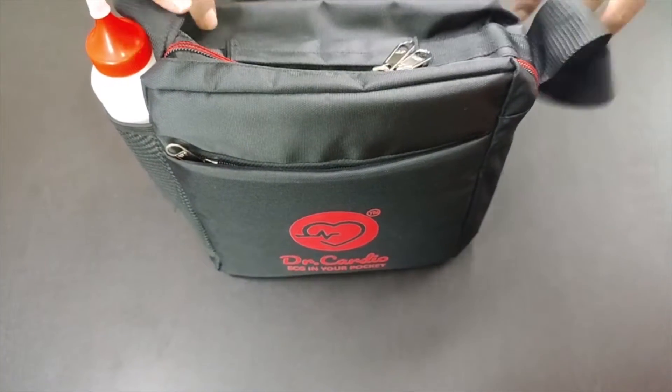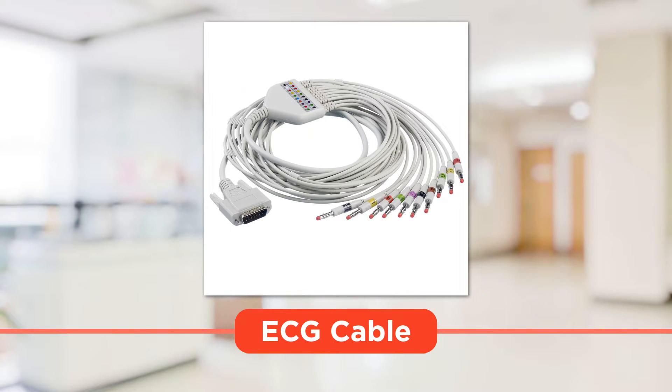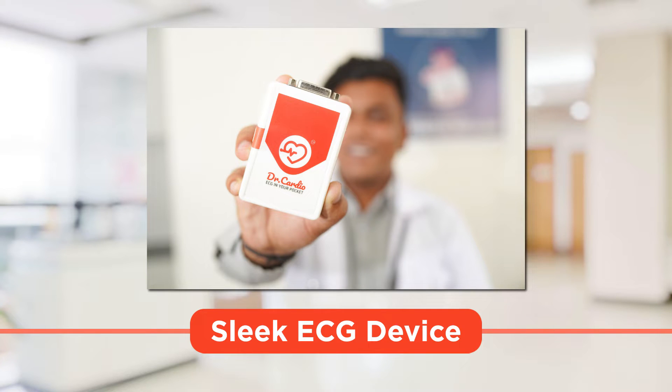This compact ECG kit includes a chest electrode, clamp electrode, ECG cable, jelly, and a sleek ECG device.